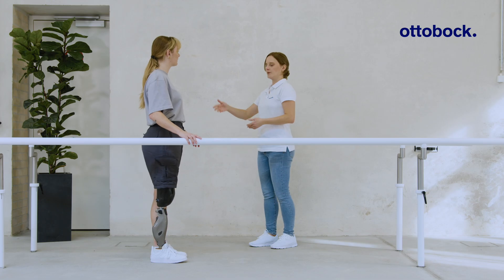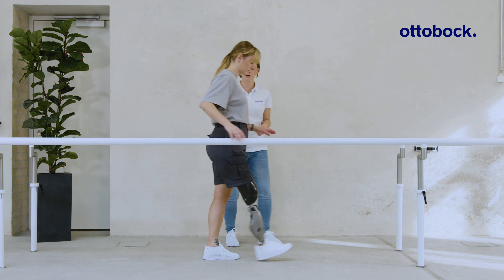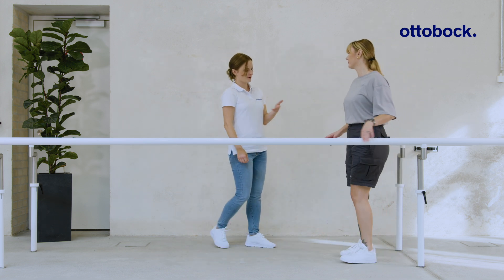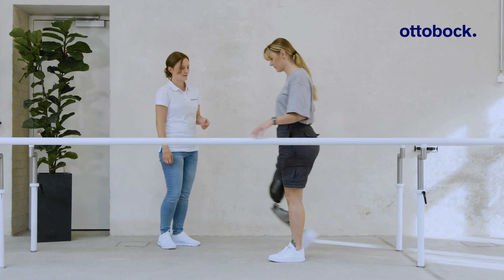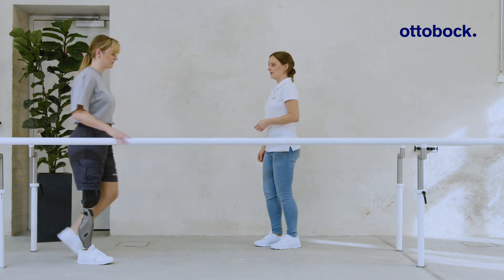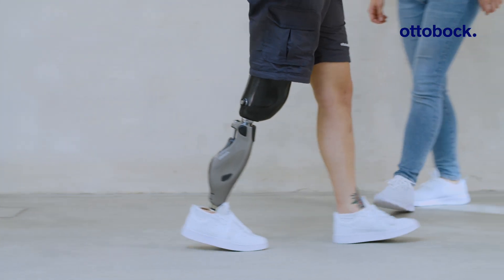It is therefore not possible to yield or walk down ramps and stairs step over step. Although the knee joint remains extended during stance phase, the user can still walk with knee flexion during swing phase since stance release is possible.